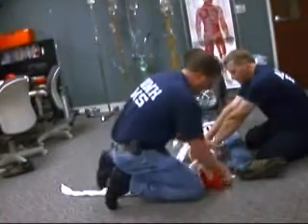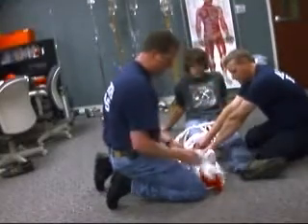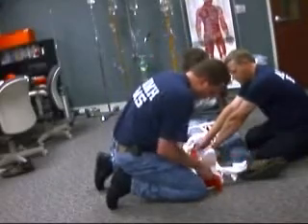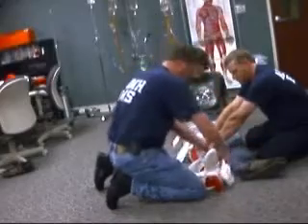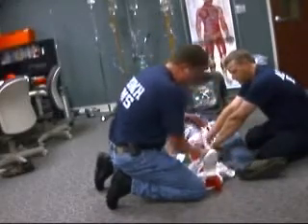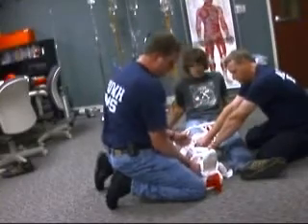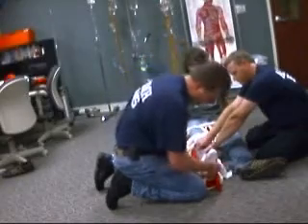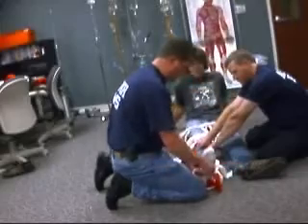We are going to fashion an ankle hitch — cross the cravat below the foot, feed them up through the ankle strap, and tie them again below the foot.